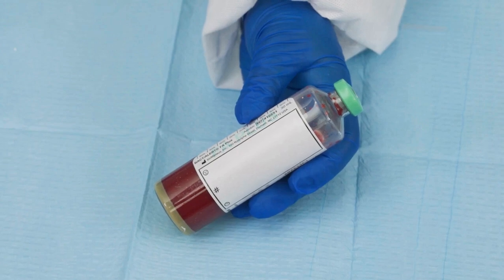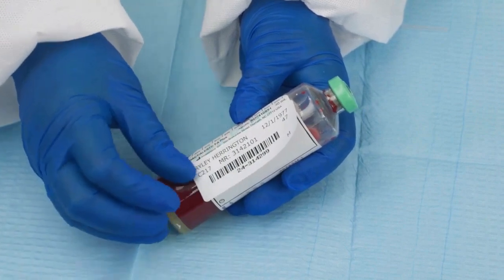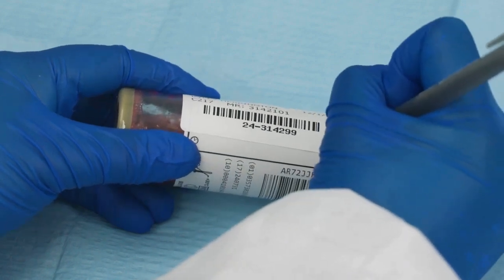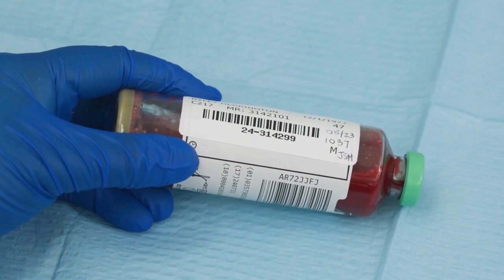To properly label the bottle, use the dedicated area on the bottle. If using a test label, place the barcode label vertically so the orientation is the same as the bottle barcode. Do not cover any of the bottle barcodes, the fill-to mark, or the window to check the blood level. Add any additional information if required, such as date, time, and collected by. Ensure that any additional labels do not cover the bottle barcode.